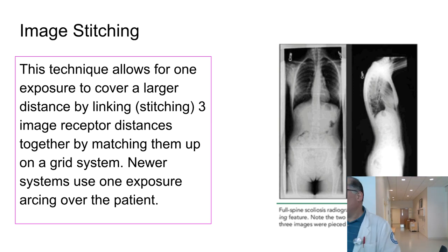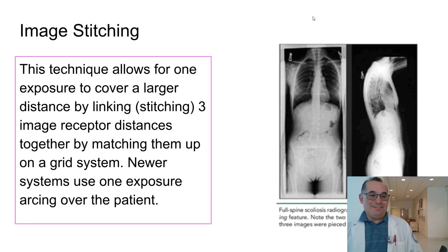Is our room open? Someone shoot a hand in there, in room one. No volunteers? Okay, so you're going to shoot a hand, use the same technique on everything. The only difference is one you collimate nice and tight, and the other one you leave pretty much open. So, while they're going, I'll just keep, you want to help? She wants help. Oh, good.